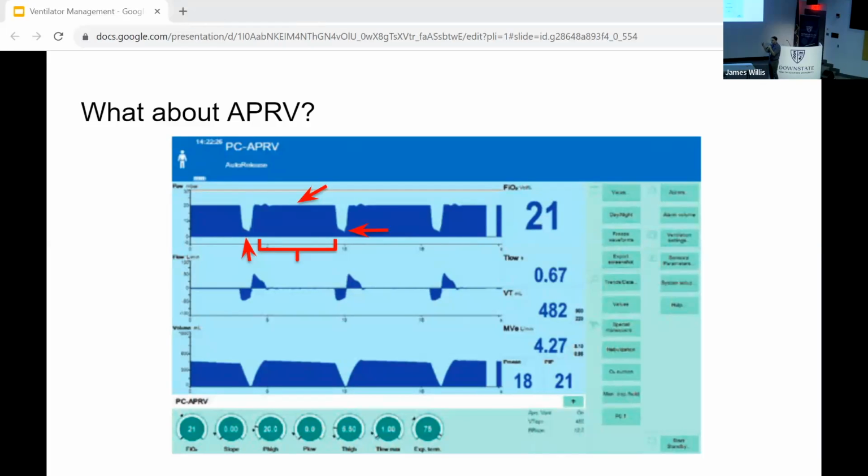So this is usually utilized most often when the patient is still hypoxemic despite those conventional modes in ARDS, in addition to some other things like proning the patient and doing some other things to try to really recruit as much lung as possible.